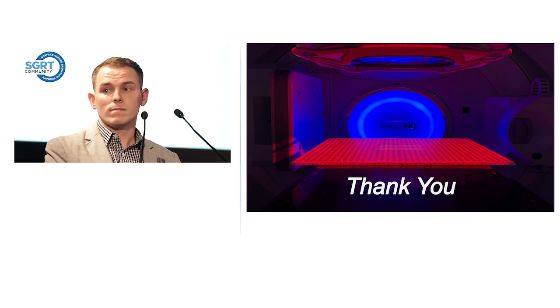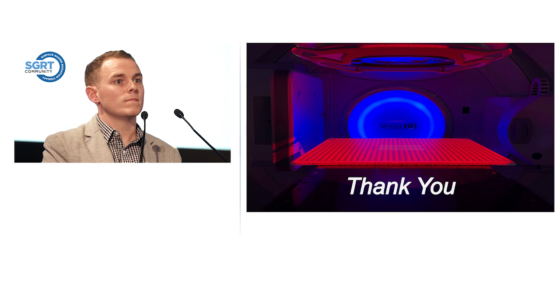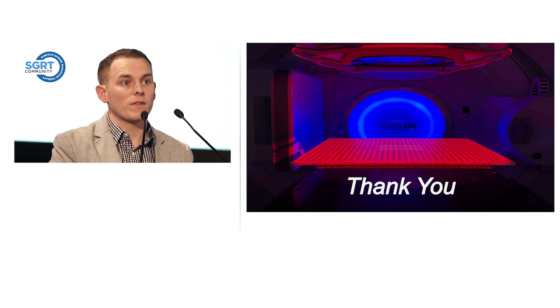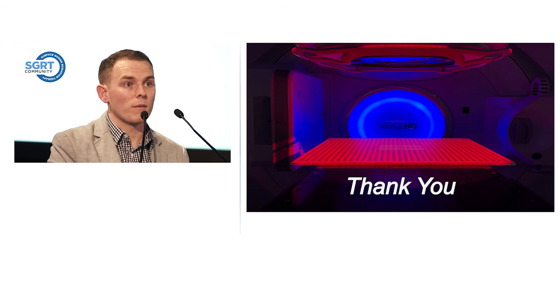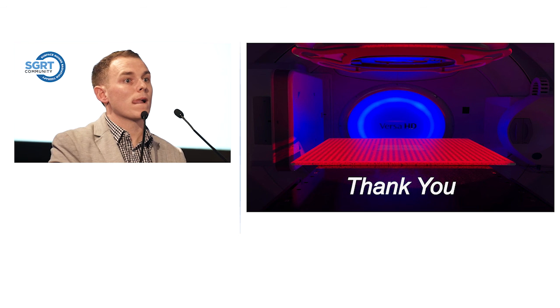Hi, Carol. We've just started using Align RT in Doha, and I was just wondering, have you tried it on any other sites yet, or are you just still doing the breast? Just breast and thorax at the minute. As I said, we do use it for every patient for monitoring. This tends to give us a good feel of how it is going to affect other sites, but we will be moving to pelvis over the next month or 2. So you monitor every patient with it? Yeah, we currently use it for every patient, so we currently import the planning CT as the reference. Do you find any benefit to monitoring other sites?